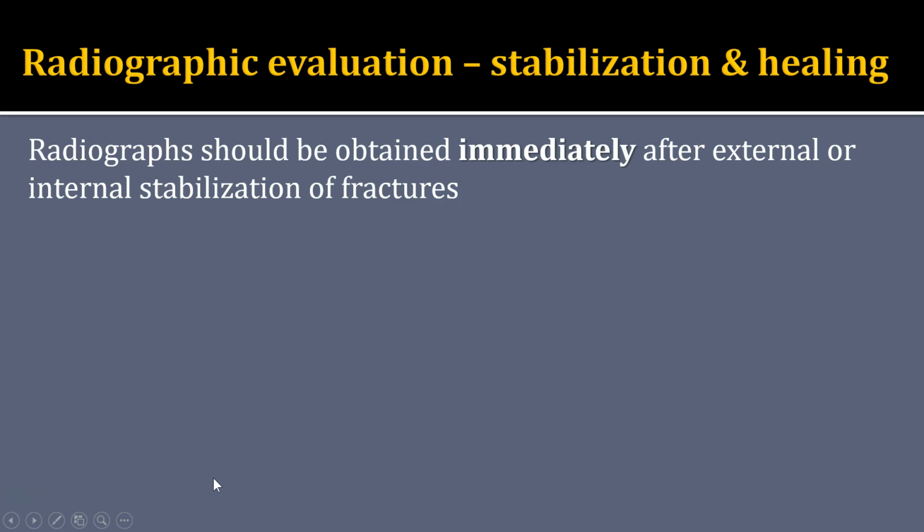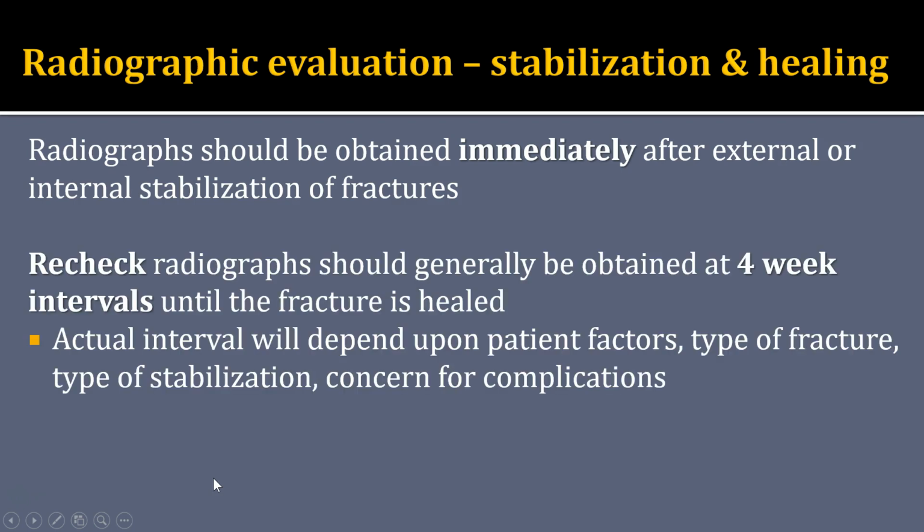When we look at radiographic evaluation of our fracture stabilization, we should obtain radiographs immediately after external or internal stabilization, so that we can evaluate how we did. Then recheck radiographs are generally obtained at 4-week intervals until the fracture is healed, but the actual interval will depend upon patient factors, the type of fracture, the type of stabilization, and if we have any concern for complications.